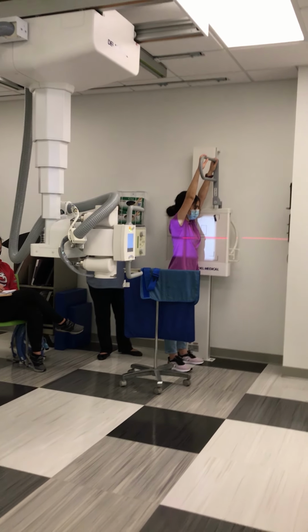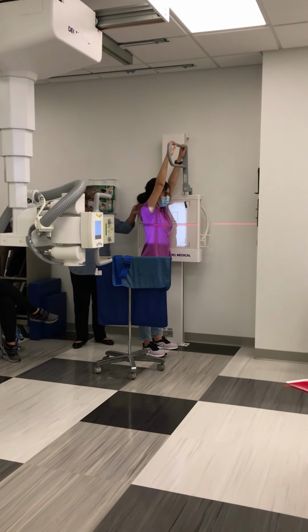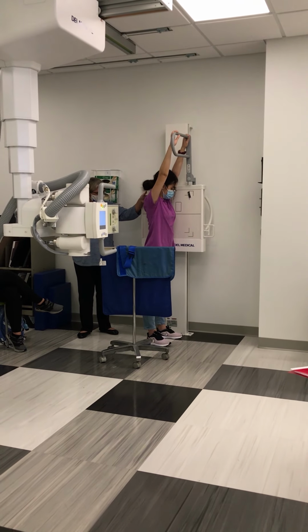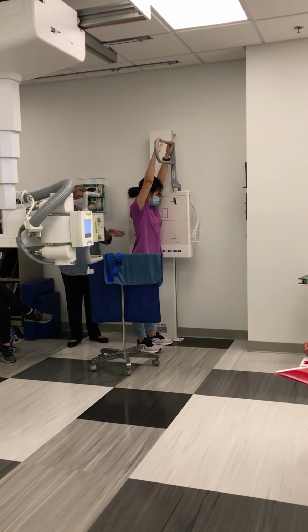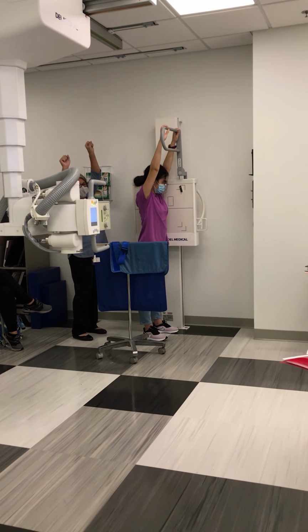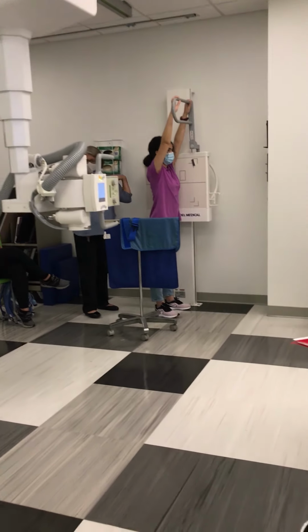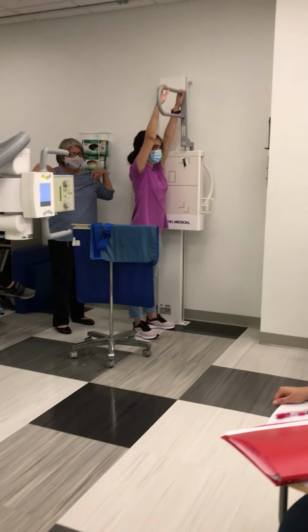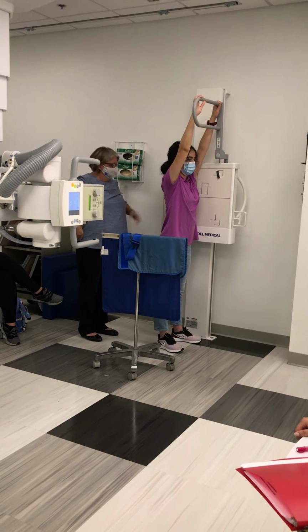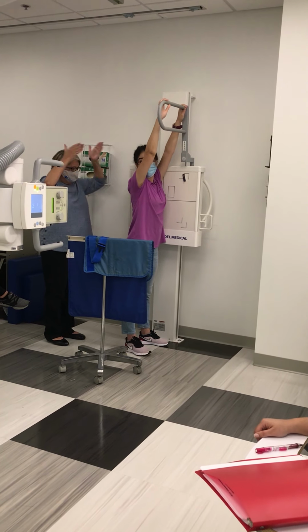But I will tell you that some people are built in a way that their shoulders are against the wall bucky. But if we got their hips against the wall bucky, that would mean they'd be leaning over to do that, and you don't want that. So somebody who has kind of broad shoulders and narrower at the hips, you may have that little bit of gap at the hips, but they're standing straight.